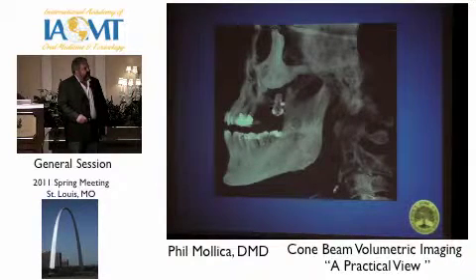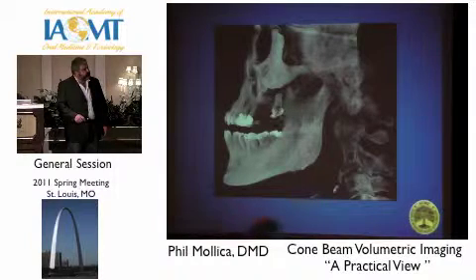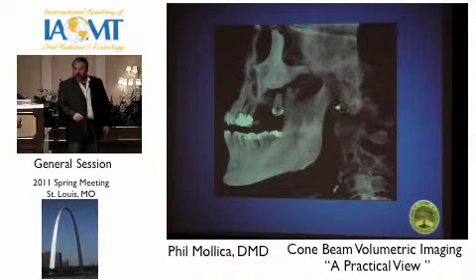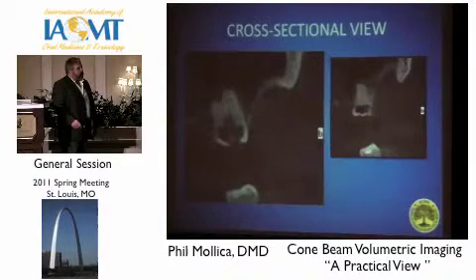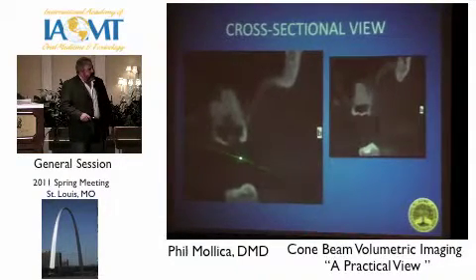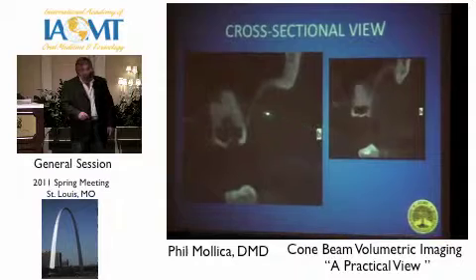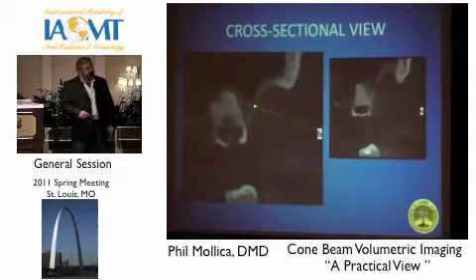We take a ceph. Holy cow. He's got this wisdom tooth jammed up in here, and all this dark radiolucent area here. But there's something interesting going on with this tooth, which did not appear in the oral cavity. We look at a cross-sectional view of the tooth. What happened here is there was actually a hole in the gum here, where the tooth was actually decayed underneath the tooth, underneath the gum, and creating this parasinus infection. This whole area is infected.